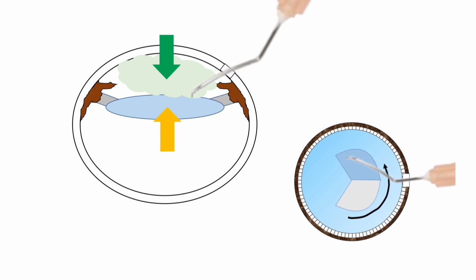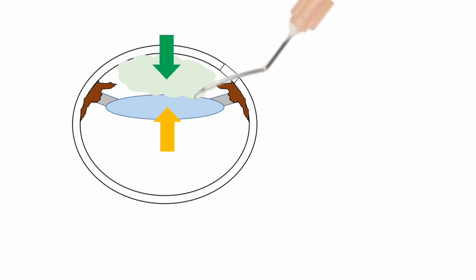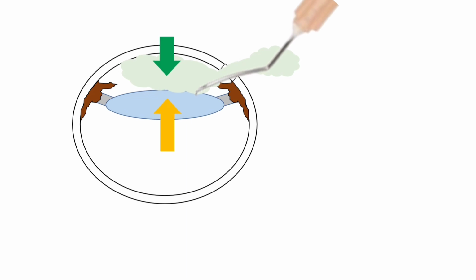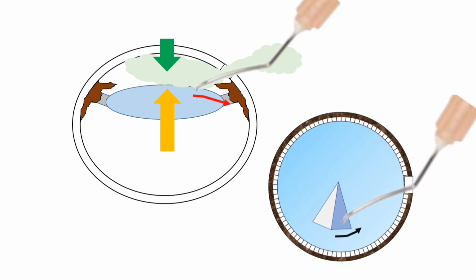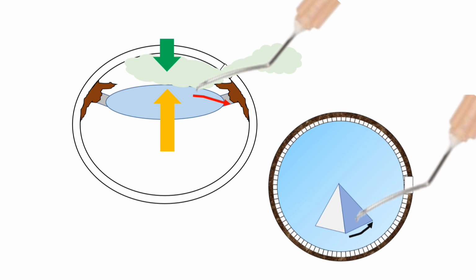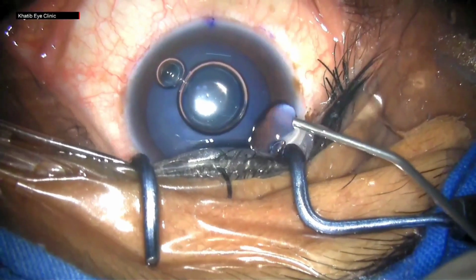the direction intended. But for example, if while doing the Rhexis, say the surgeon presses on the wound, the viscoelastic will leak out and the lenticular upward force will now overpower the downward force. This will lead to an outward vector force along the anterior capsule towards the equator. This changes the direction of the Rhexis vector because an outward vector now comes into play and the Rhexis will start to run out. Now let us see a case example.